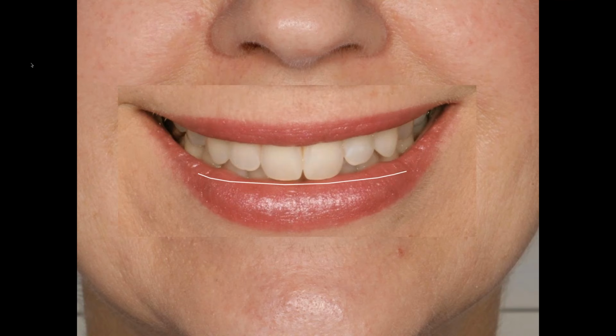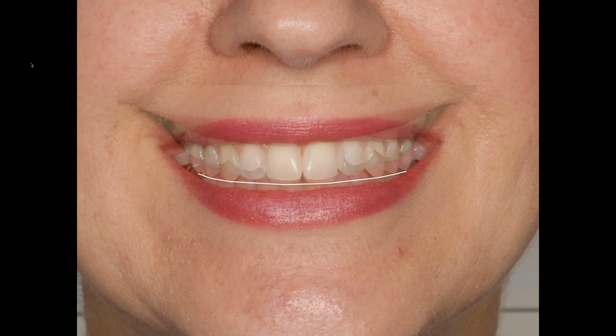Now, what happens if we shoot from above down? Look what it does. We're shooting from above down, it accentuates the curve, and again, it gives us false information. We could never use this to try to verify a mounting in an articulator. If we don't coordinate with our clients and they don't take the pictures properly, and everybody on the team doesn't understand all this, it's going to be a losing battle the whole way through. Okay, so again, I just wanted to give a little insight into why this is so important. And again, remember, if you have a line on the floor, you can have the patient straddle that and put the tripod on the floor, and that keeps your left to right straight as well.